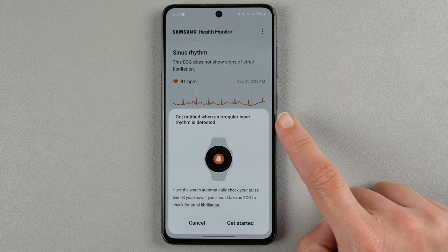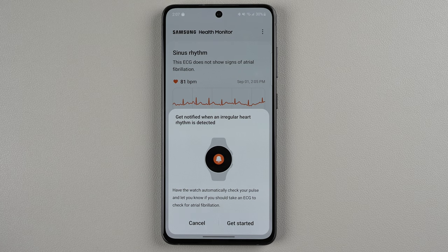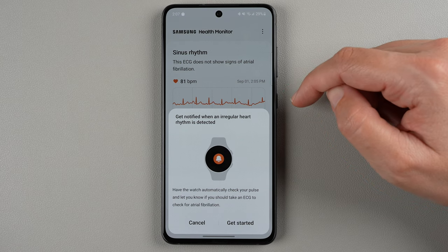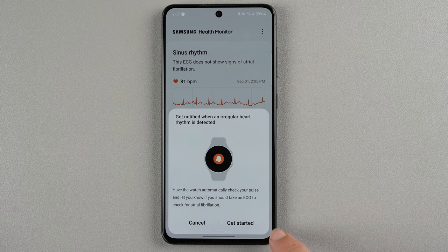Get notified when an irregular heart rhythm is detected. Have the watch automatically check your pulse and let you know if you should take an ECG to check for atrial fibrillation. It sounds like it will monitor in the background and if it thinks that you have an irregular heart rhythm, it will prompt you to take a more accurate measurement with the ECG app. If you want to do all this, you can tap get started. If you're not interested, you can say cancel. I also notice in the background it is showing my last result, so I'll go ahead and tap get started.